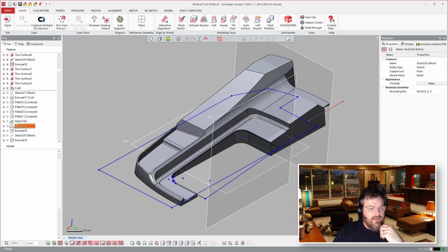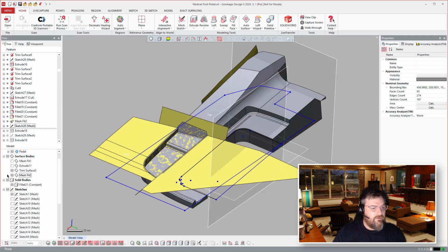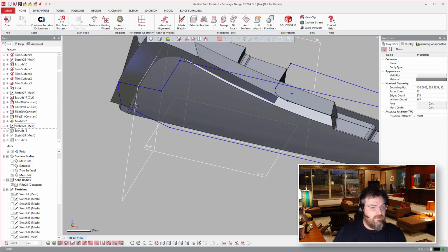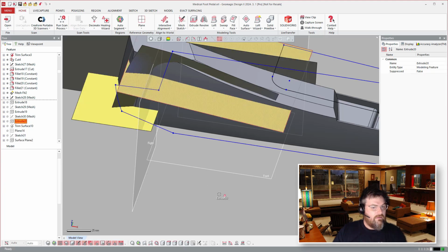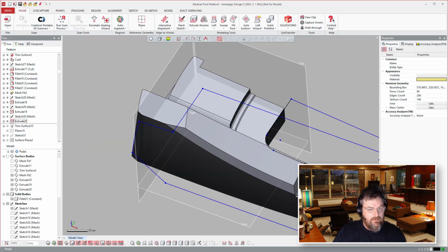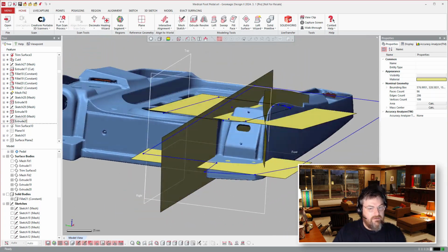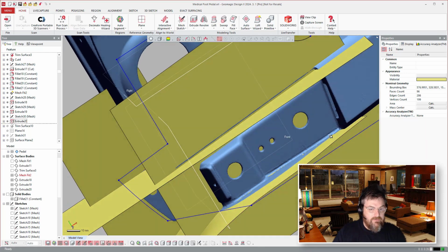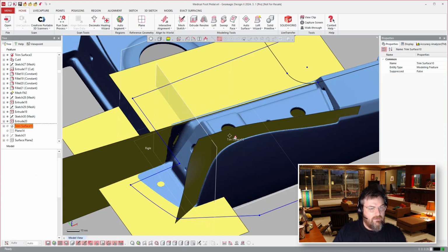So now let's just go down a few more steps and roll forward and check out this next mesh fit that we have. All right, so now we have that mesh fit. We can go ahead and turn on the surfaces, hide this one, and see that we added this other guy. And it looks like we're going to fit some more extrudes. And then I'll show the mesh here in a second. So there we go. We'll hide the solid, turn the mesh on, turn the surface on. So you can see where we're going here, where we're creating this surface here. And then we'll go ahead and roll forward and trim these together.